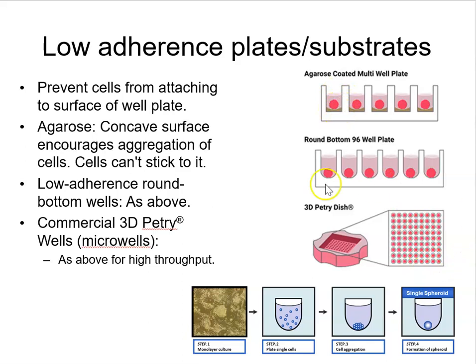You can buy these little special inserts that are microscopic, so these will take about 20 microliters of cells and create thousands and thousands of tumour spheroids. So these are sort of commercial 3D cell culture plasticware, very expensive, but they work very, very well.